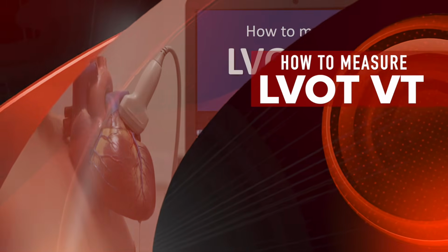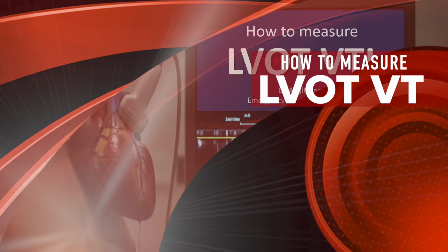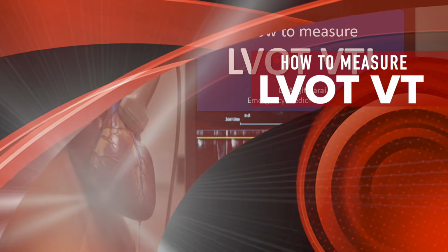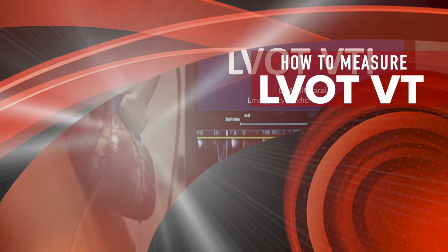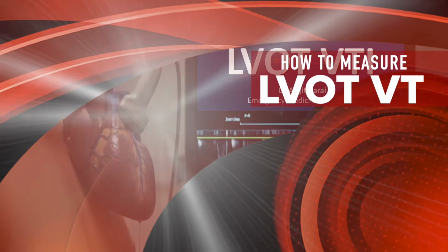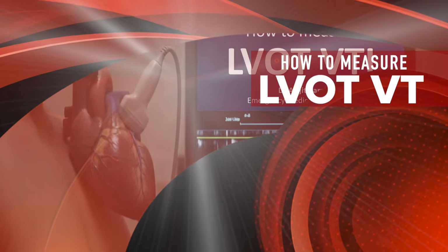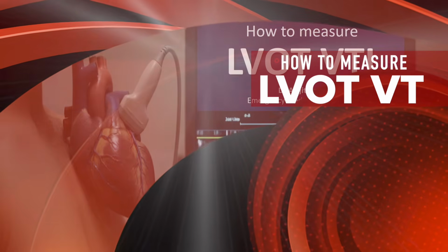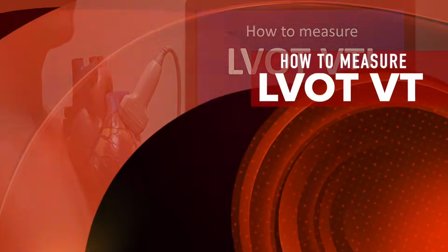Over the next half an hour or so, we are going to talk about how to measure LVOT VTI, or left ventricular outflow tract velocity time integral. This is a step-by-step approach that you can use for the assessment and management of your critically ill patients.